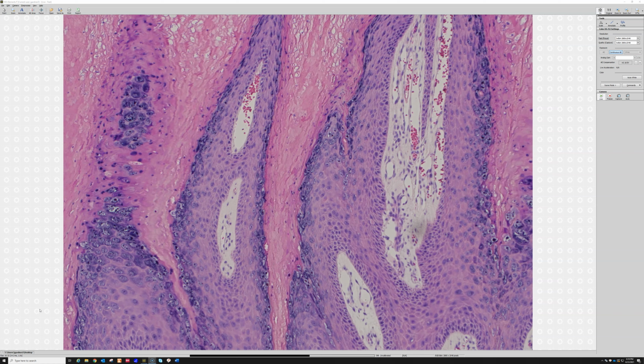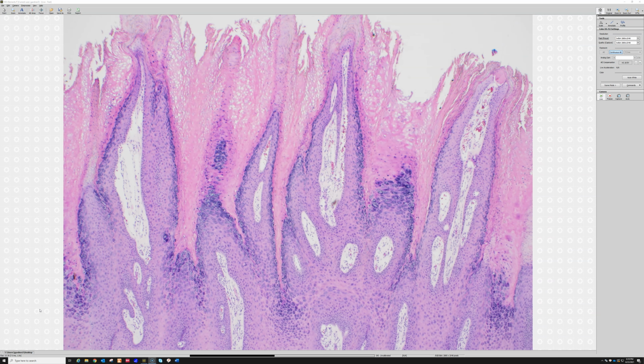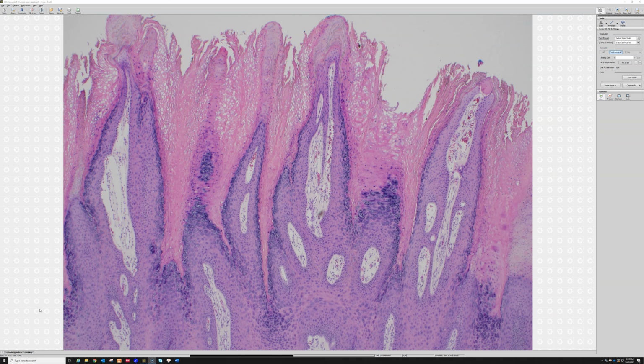And then look at these papillary structures, these finger-shaped projections. Go out one power here. They're not purely keratinocyte, right? They're lined by epidermis, basically keratinocytes on the surface, but in the middle they have a fibrovascular core, which is basically just a broad extension of the papillary dermis that's grown up as this papilla has grown up.